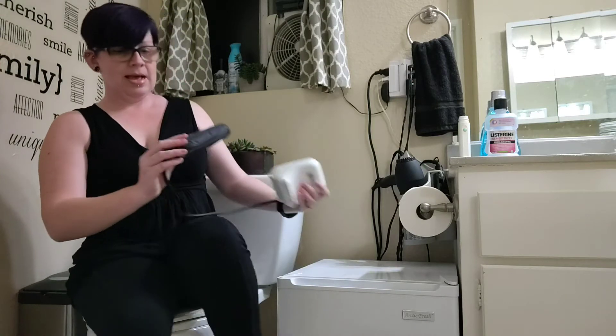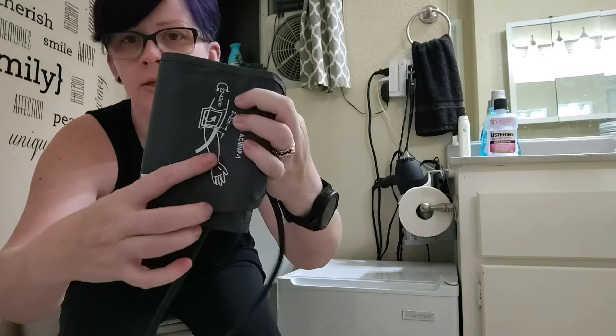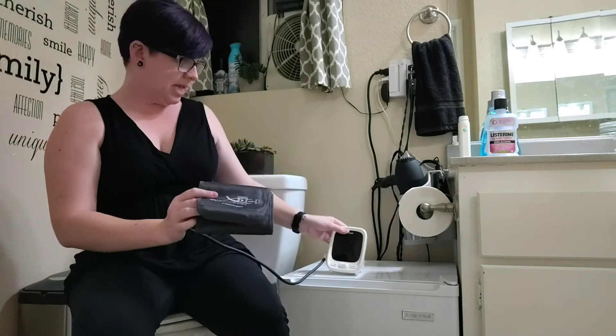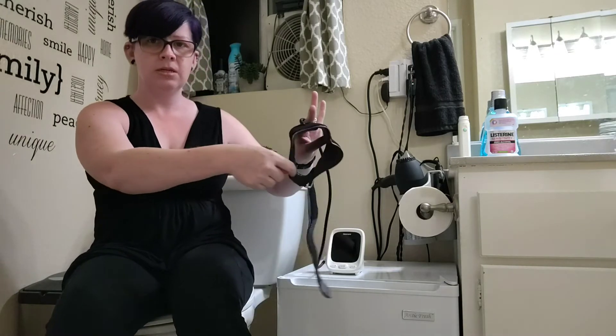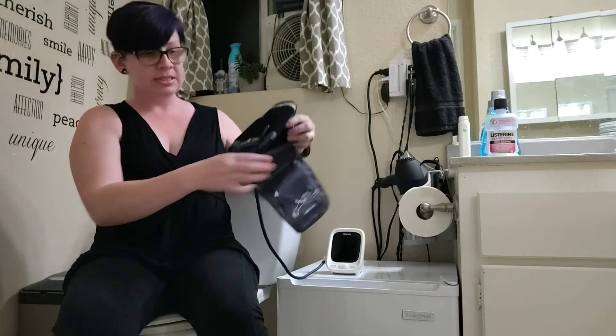Another thing I like is that the cuff is easy to put on all by yourself — you don't need help. It also has reminders on how to put it on. It shows you that the tube should be on the side where your hand is, not your shoulder, and on the inside there's a marking showing where the artery is, so you know which way to have it turned.